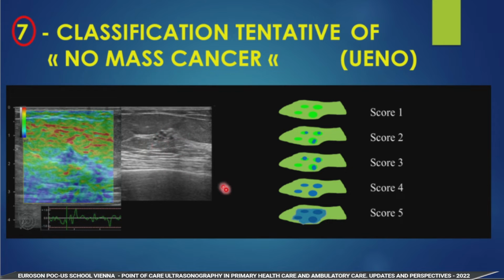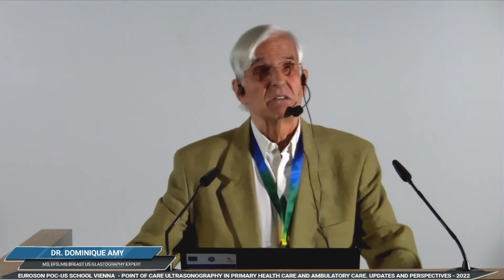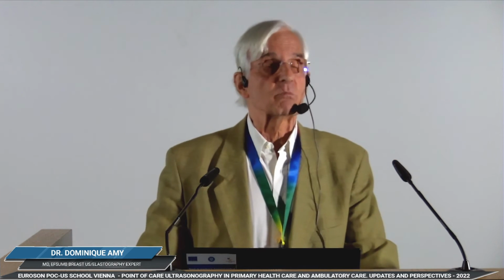You have a score 5, and you assert, take care, don't say that it's only a microcyst, but you have something wrong, and it should be carcinoma, and then you make an echo-guided puncture. You understand that elastography is not a video game, it's not a joke. It gives you a lot of information, and you are going to have a very acute diagnosis and help in the diagnostic and the treatment of the woman.